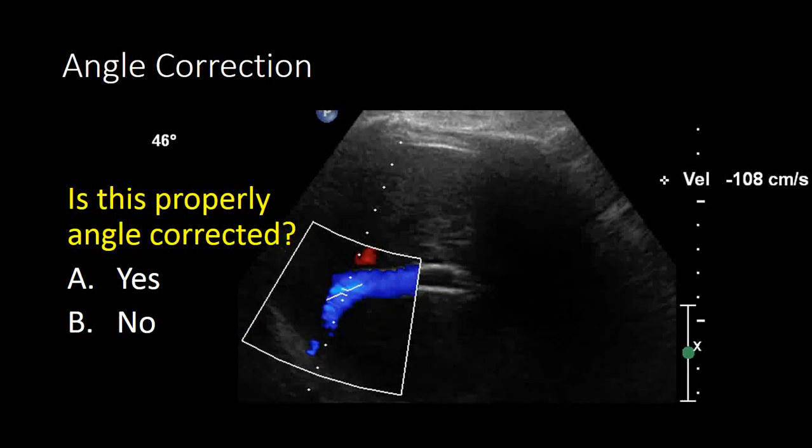So let's look at this and decide whether it is properly angle corrected.